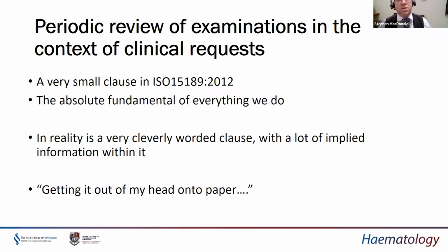Because when I discussed this with an accreditation assessor quite recently, they were asking me, how do you do this? And I told them how I do it, and they said, okay, where's the document that shows me that you do that? And it took me a while, and I found a line in a document that stated that, and then we had to discuss whether that was suitable or not. Since then, I've rewritten the documentation so that now I have an explicit explanation within my documentation.